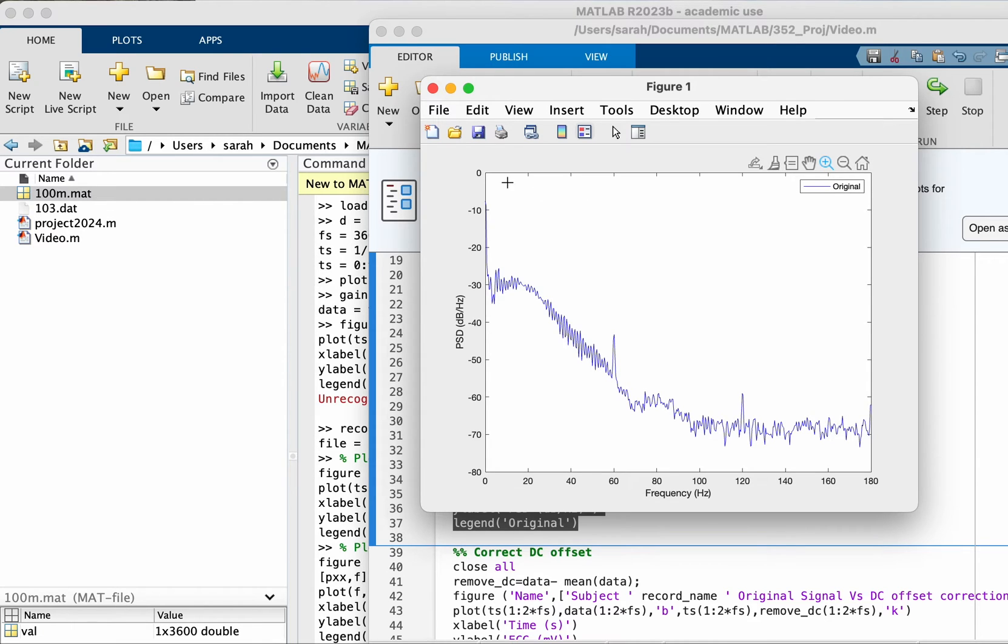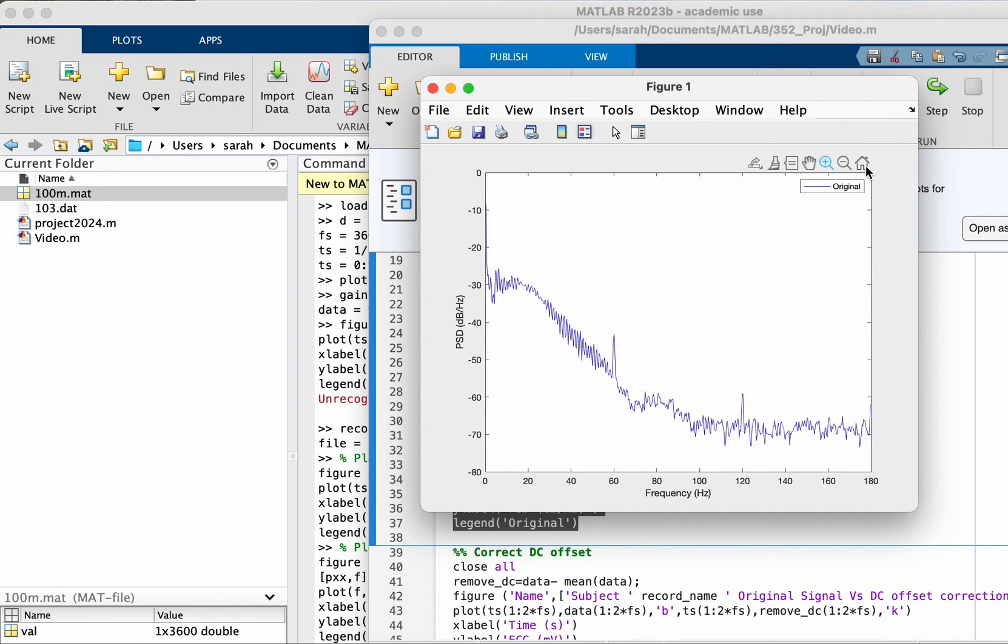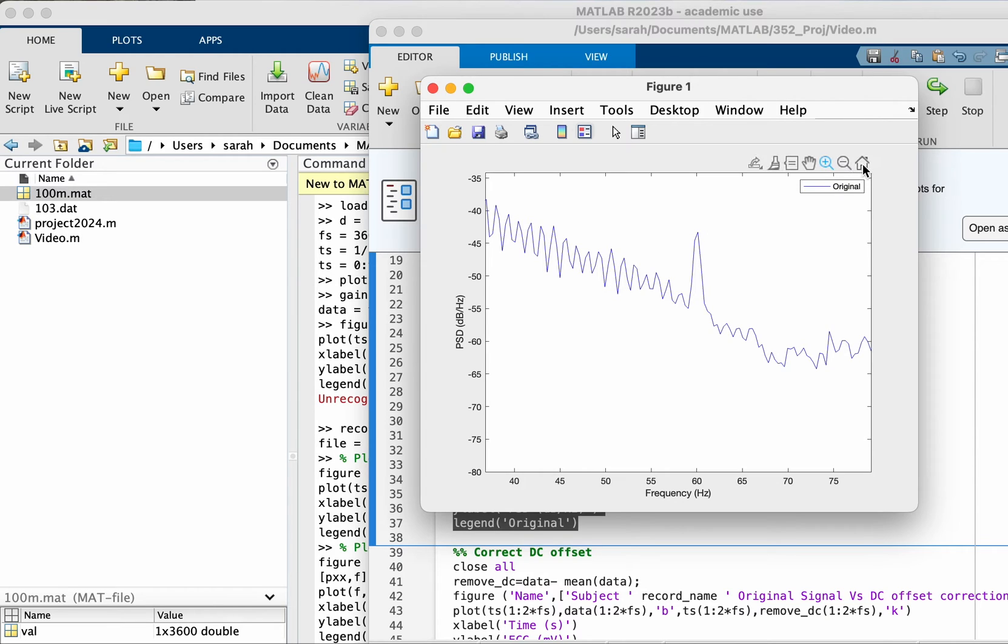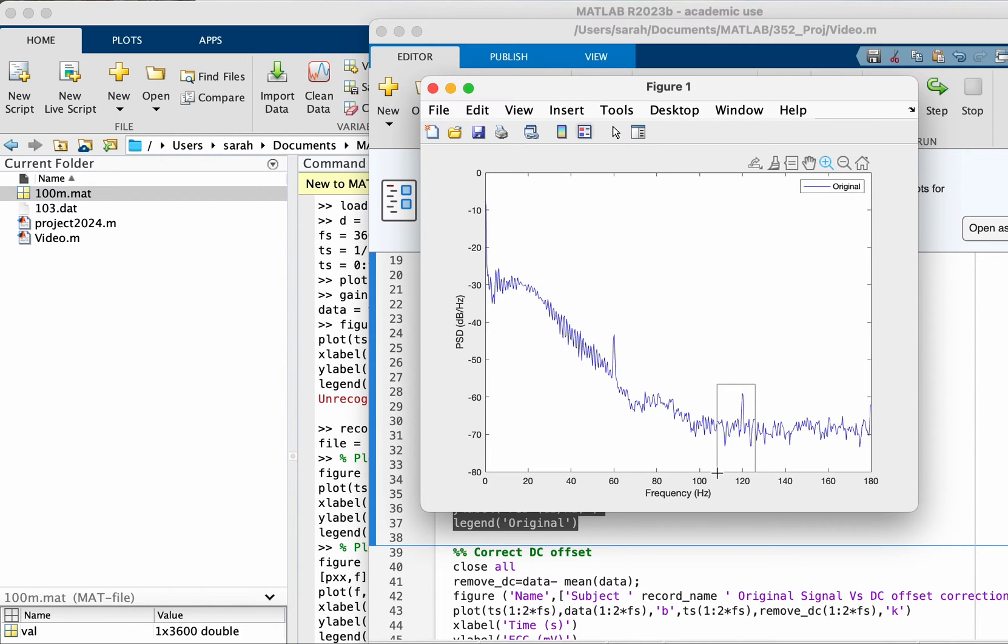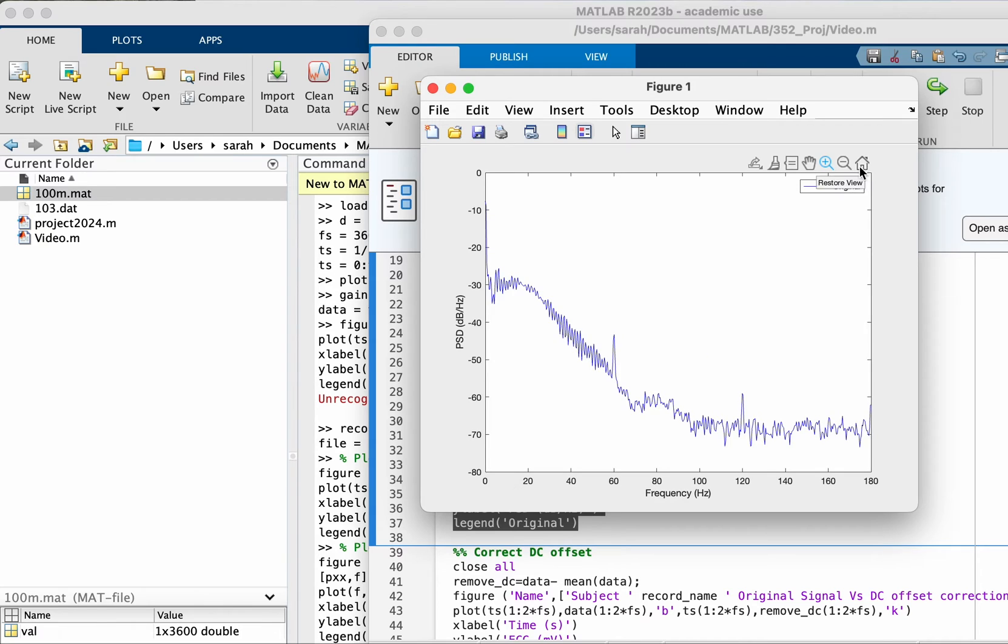For example, you can clearly see the DC offset at frequency zero, we're going to try to minimize this. You can see also that we have a peak here at 60, so this means the signal has power line interference. Obviously it would have low frequency noise and high frequency noise.